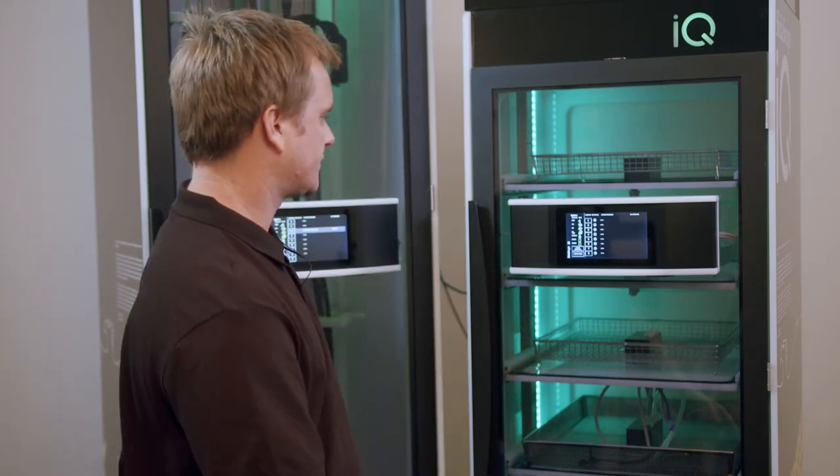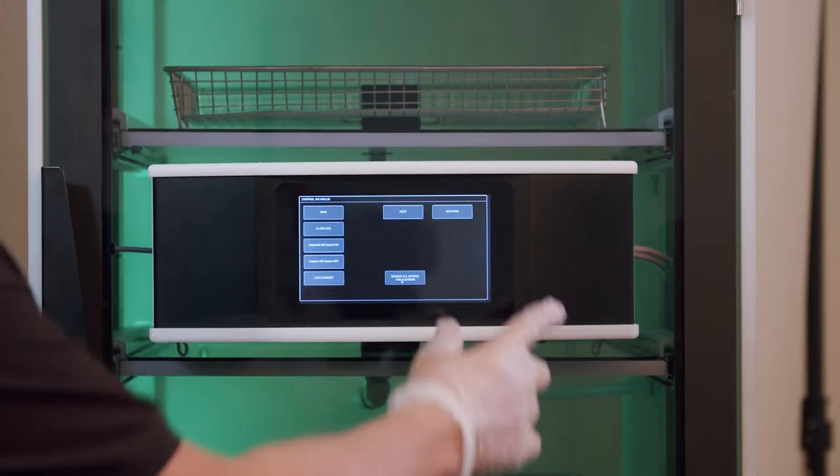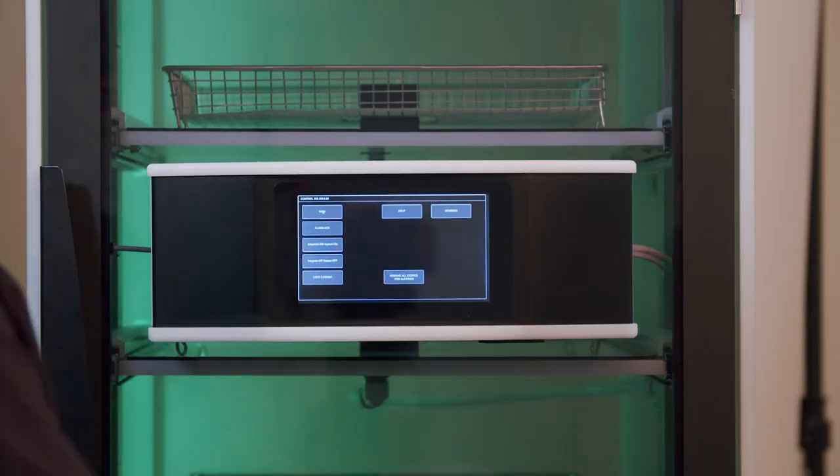So when it comes time to clean it, first of all, click on the control panel and click removal, which digitally removes every single scope from that cabinet.